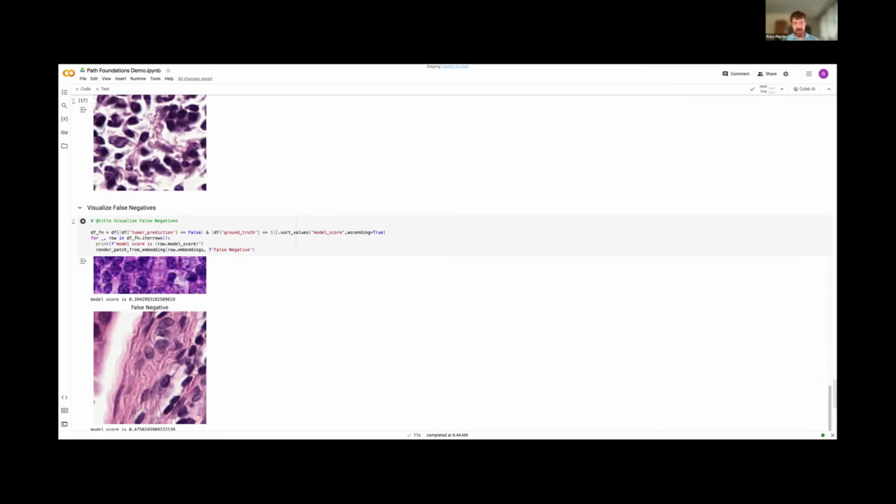So to give you an example, to get this kind of performance in the past, we would need tens of thousands of labeled patches. We've done it today with just 500. So that's the power of this foundation model. And we're really excited to see, as people get access to this, what applications they want to build for problems where AI can help them in the day-to-day of life using data they've curated themselves, because the scale you need is actually much lower than before.